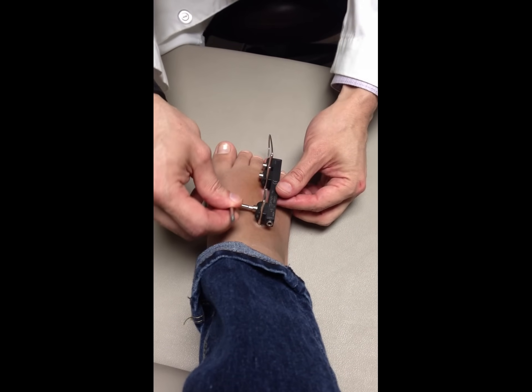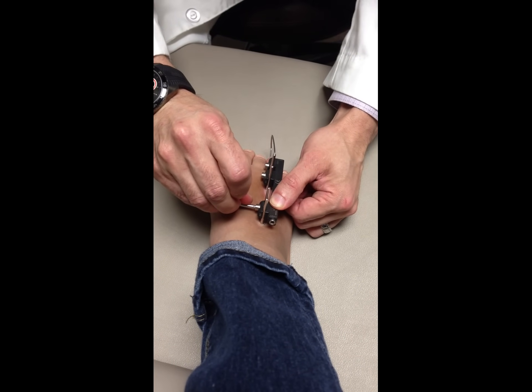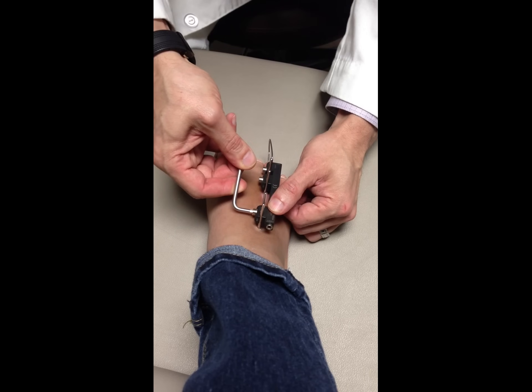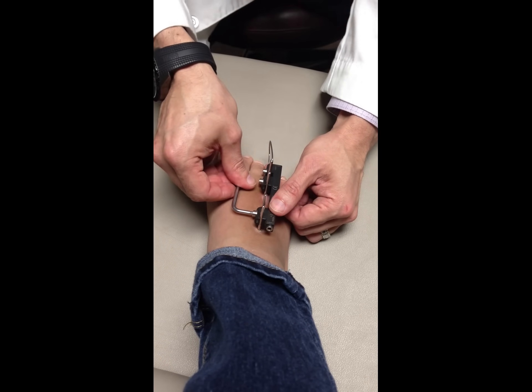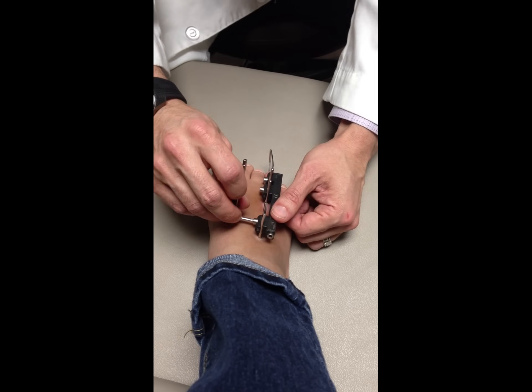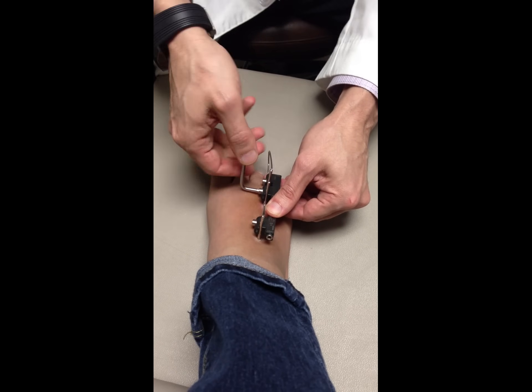This is a very non-painful procedure. I'm going to loosen this screw lightly — she'll probably feel something funny. Did you feel like an increased pressure or something like that? I actually don't feel anything. Okay, good. And then the second one.